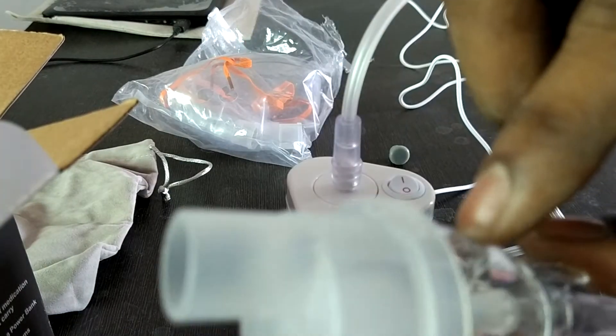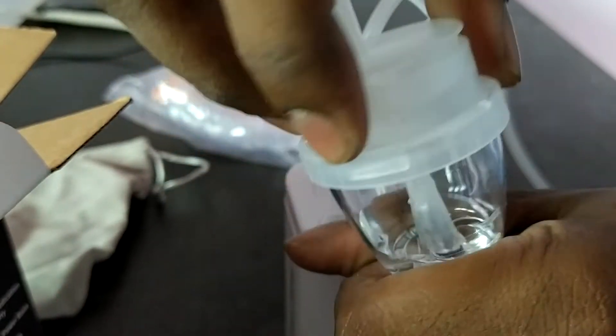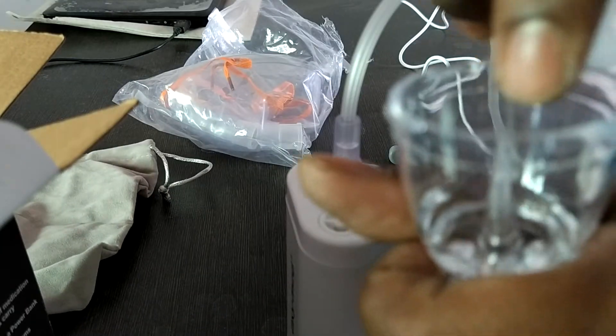The medicine will get inside of this — you can just open it, put the medicine. I have put water.